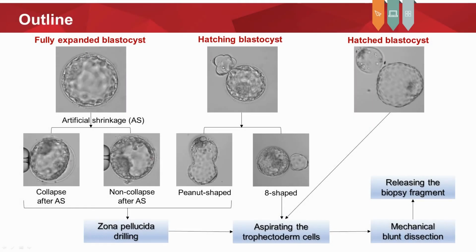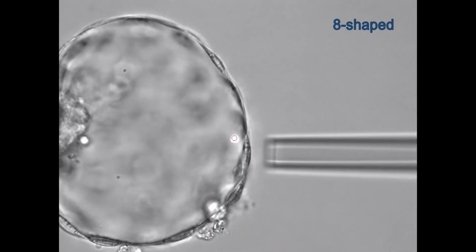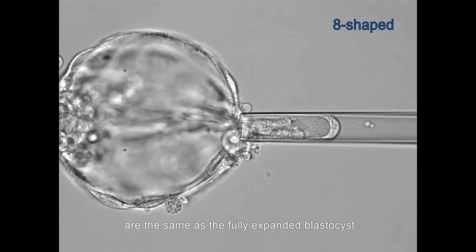The biopsy of the 8-shaped hatching blastocyst is relatively simple. The embryo is secured by the holding pipette at the opposite side of the herniation of the trophectoderm cells, and the subsequent steps of the trophectoderm biopsy are the same as the fully expanded blastocyst.